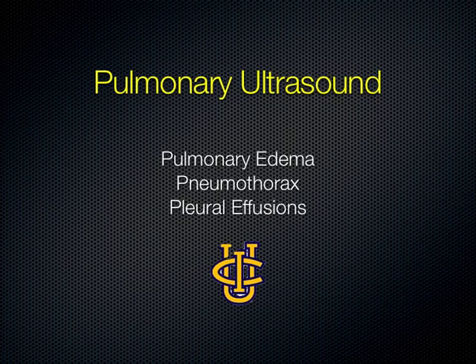Thanks, Chris. So today I'm going to talk about pulmonary ultrasound, and this is a relatively new field, although in Europe it's been going on a lot longer than we've been doing it in America. There are actually some intensive care units in Europe who don't use chest x-ray for very much at all. They use ultrasound to look for pneumonia, pneumothorax, line placement, endotracheal tube placement. They use ultrasound for all of that.